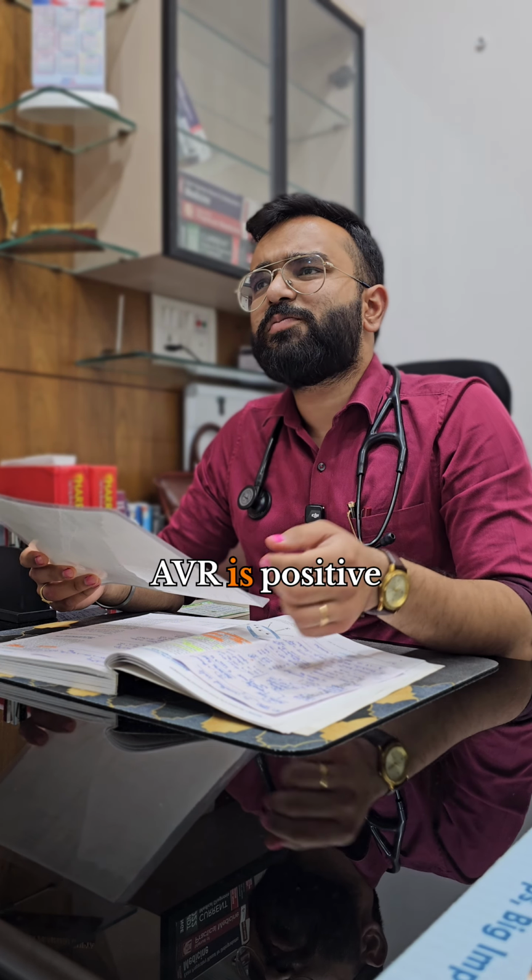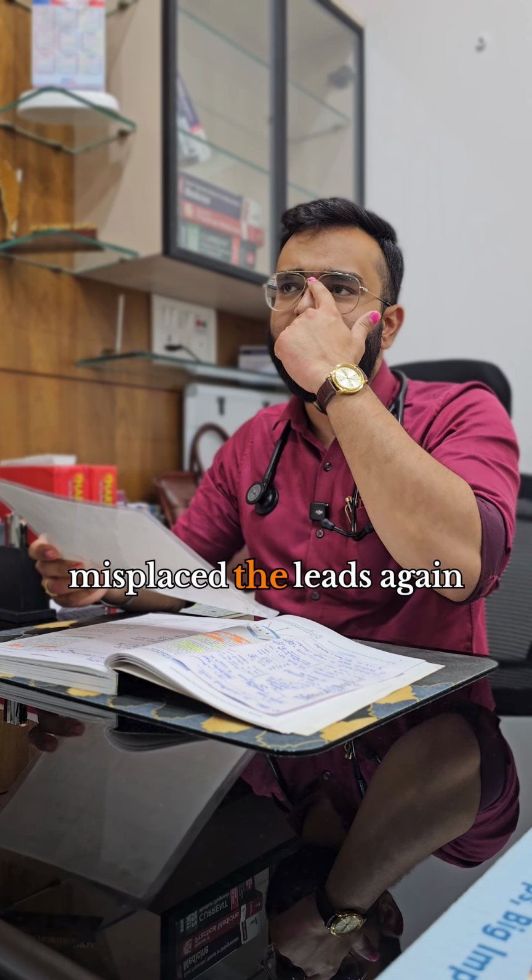Oh, AVR is positive in this one. You've misplaced the leads again. Let me teach you. So, you guys also learn.